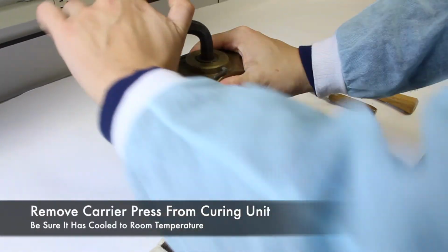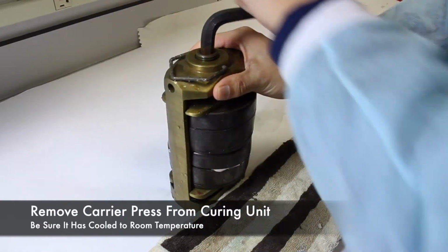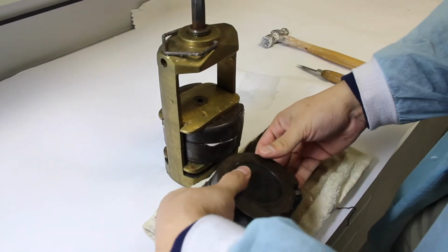The first step, as before, is to remove the carrier press from the curing unit and then retrieve the flask from the carrier press.